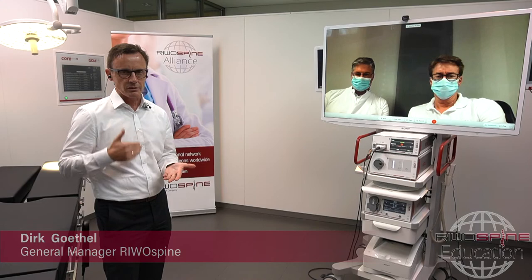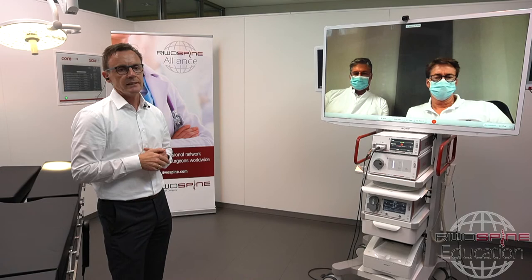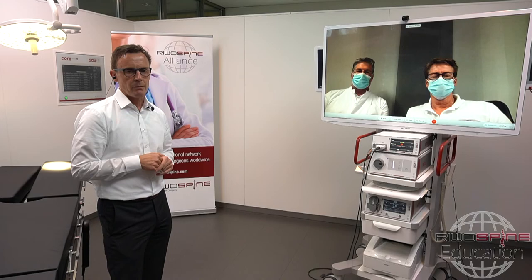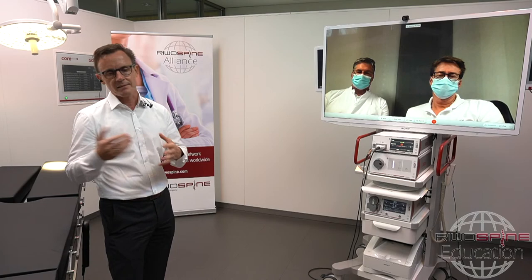And that's important. And on the other hand, if you really want to make 100% sure that you will never close the outflow even during the surgery, then you should use a pump that regulates the pressure very safely inside. For that, we use a very special pump, the spine mode, and this pump makes sure that the intraspinal pressure will never be higher than 40 mmHg. So these are the two recommendations for that.